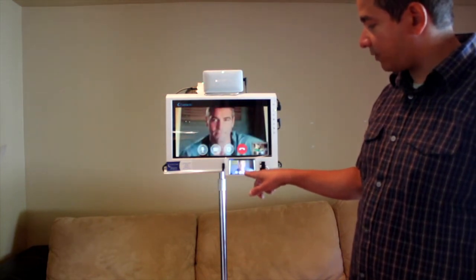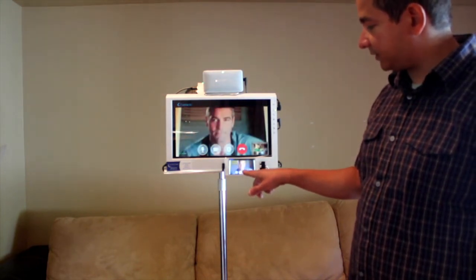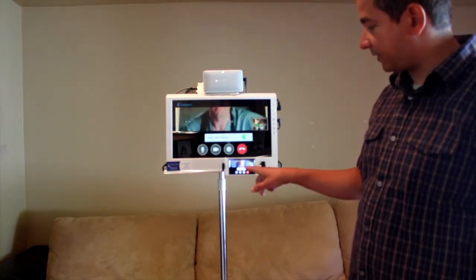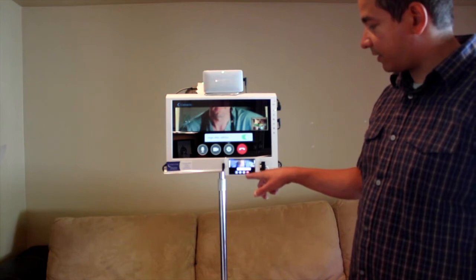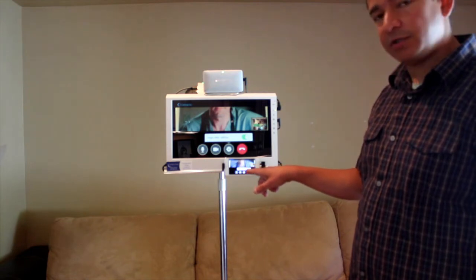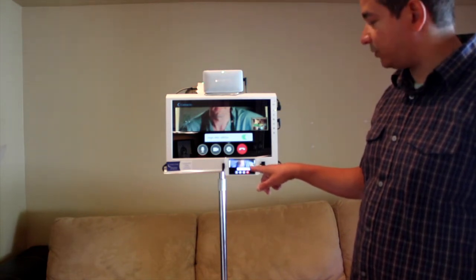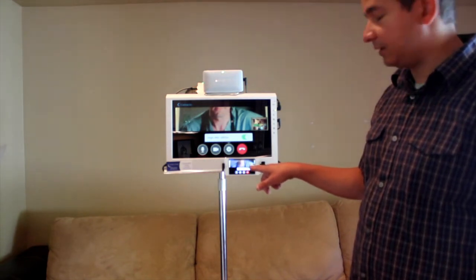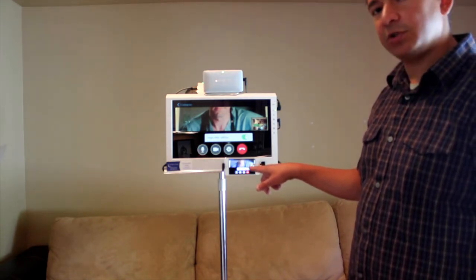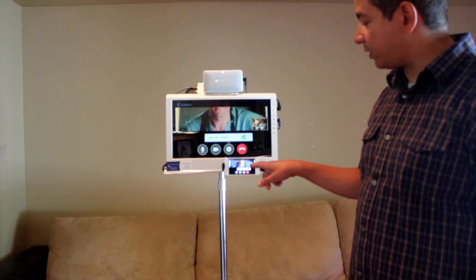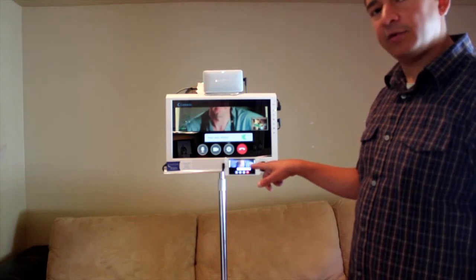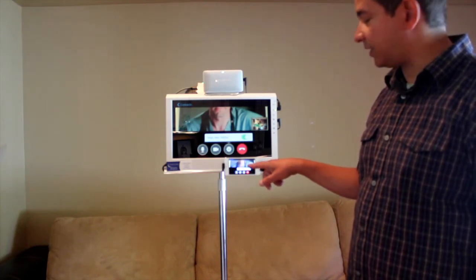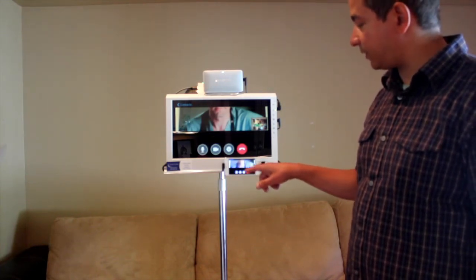There's also a cog wheel next to that — that's a system icon. It enables you to change the resolution; you want to keep it in the default resolution. It also enables you to turn on the flashlight if you're using the rear camera.